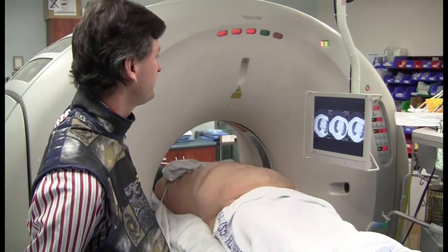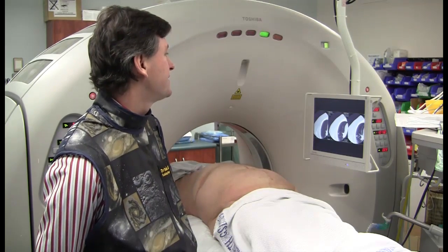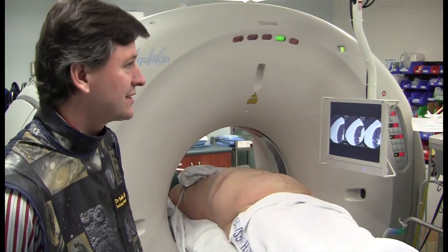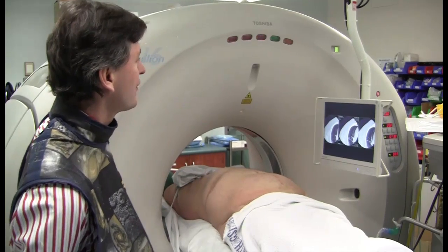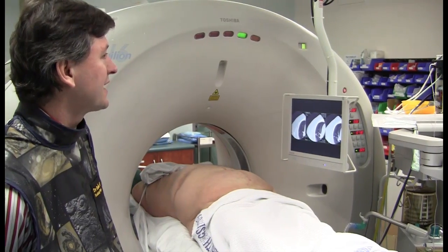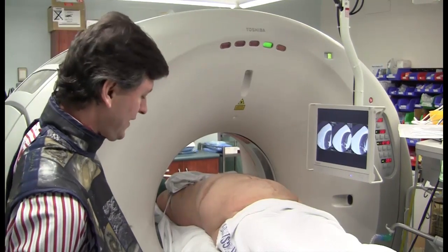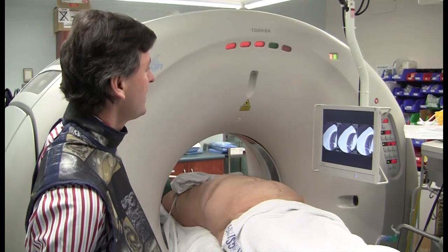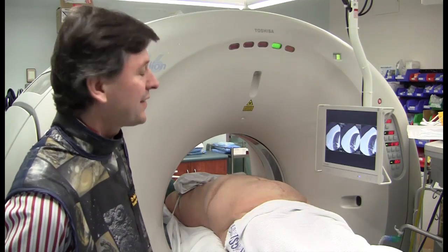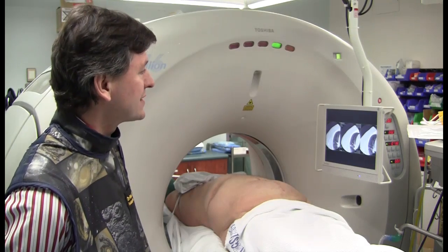Looking at the image quality we're getting — this zoomed image is way more than we need, so we can run the dose back. Let's take it down to 20 mA from 50 mA. These are 4-millimetre slice thicknesses, which is about the spatial resolution we need. With fluoro CT, we get spatial resolution through zoom. At 20 mA — less than half the dose — image quality is still perfectly acceptable. We can take it right down to 10 mA, the lowest dose the machine can do, which is about 1/40th the dose for a typical diagnostic slice, though that's getting a little noisier than I like. Let's go back up to 20. With fluoro CT there's no kernel manipulation — to get spatial resolution you just magnify the image.